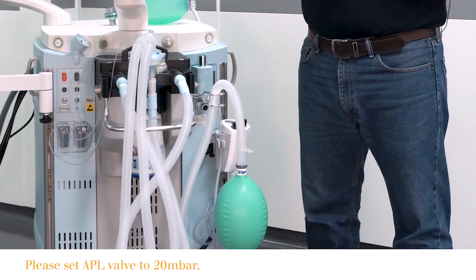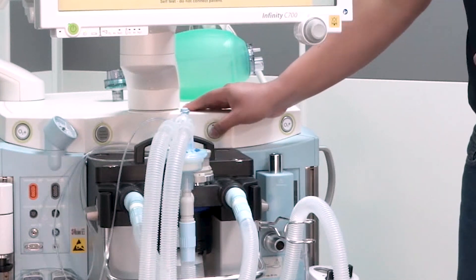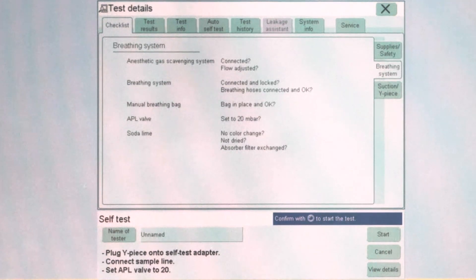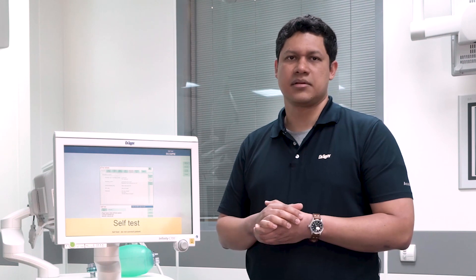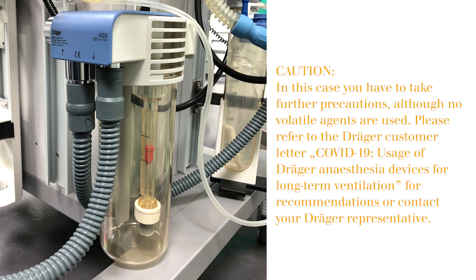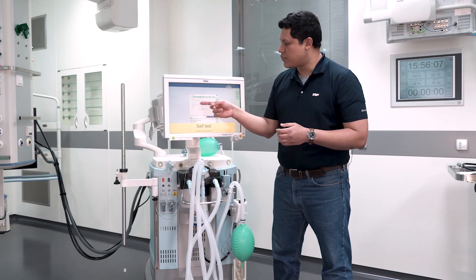Then we return it to its original place. The next group of components to verify are the ones related to the breathing system. In first place, we have to make sure that the anesthetic gas scavenging system is connected and it is functioning. You verify that by visually inspecting the back of the anesthesia device. The next element to verify is the breathing hose system.